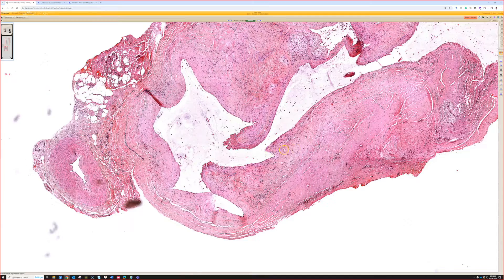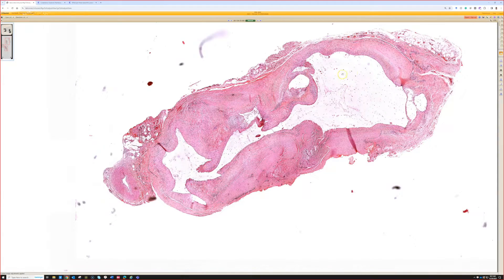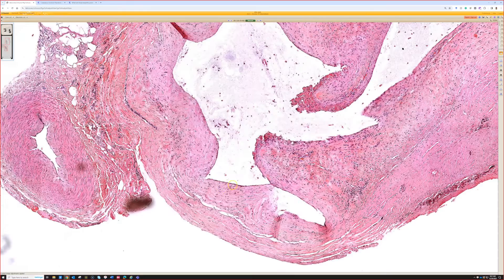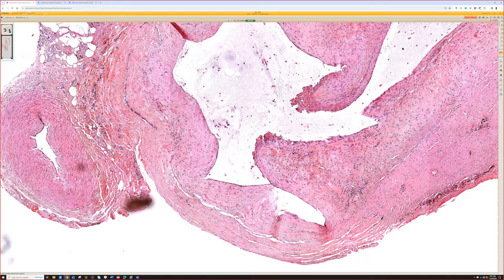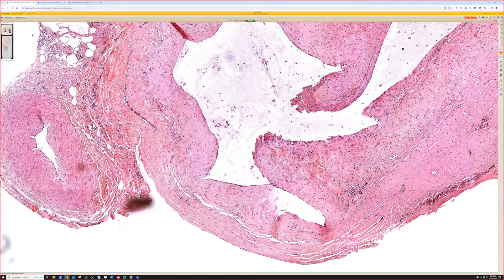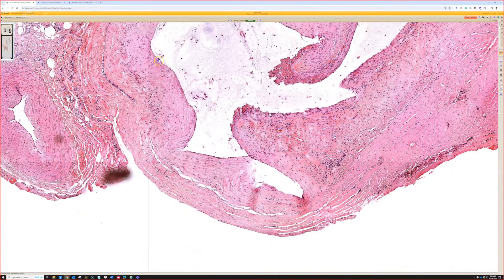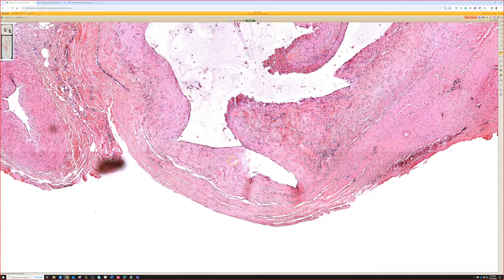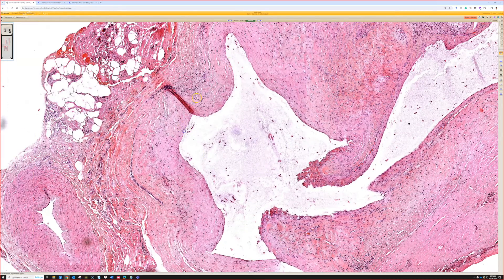When it's a perfect intact cyst like this, no problem - but a lot of times we don't get it all; the contents wash out and we just get a fragment or the edge. Being able to see dense fibrosis with a sharp-lined edge and no lining cells is useful because it tells me we're either at the edge of a synovial or ganglion cyst, or maybe at the edge of a pseudocystic capsule around a foreign body that fell out or was removed intraoperatively, or it's a capsule around a breast implant - which usually gets a lot of synovial metaplasia.